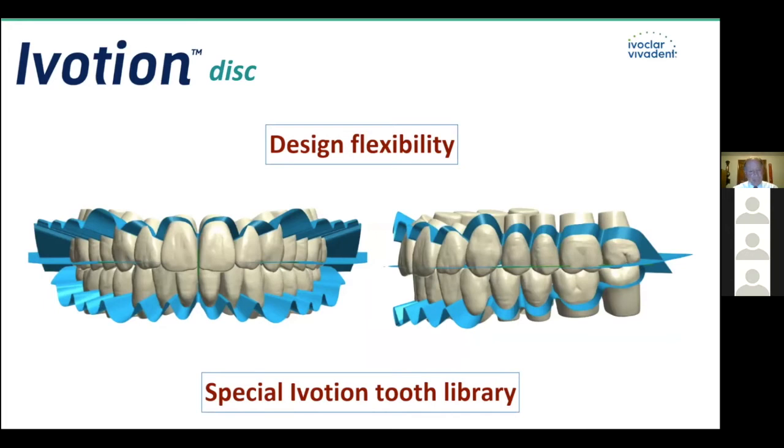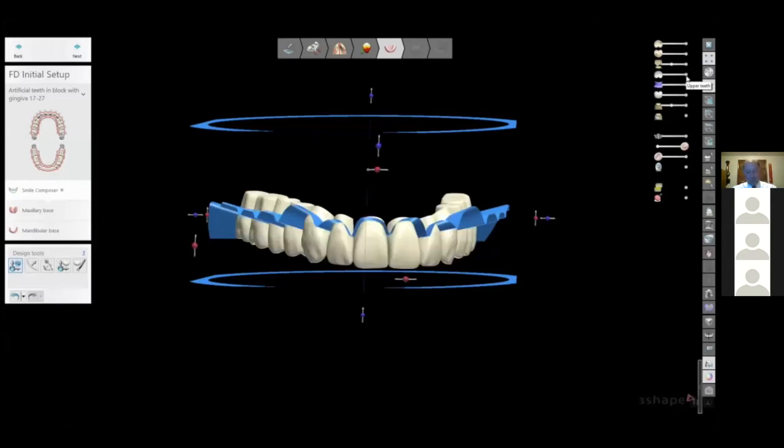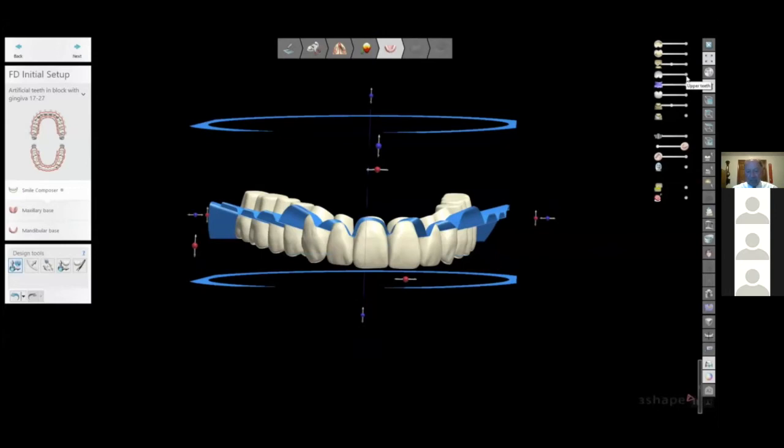And as I said, I still look at it and I do it and I work with it. I still can't quite believe it, but it does work. Just to show you, I hate to get too techie because I'm not techie, but this is something I put up on the screen, and you can see this ribbon, and there's little handles here. You could adjust this ribbon and it basically changes the height or the length of the teeth. So this gives us some actually added flexibility compared to other techniques.